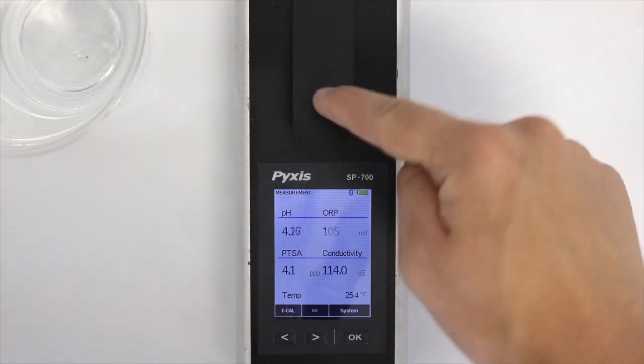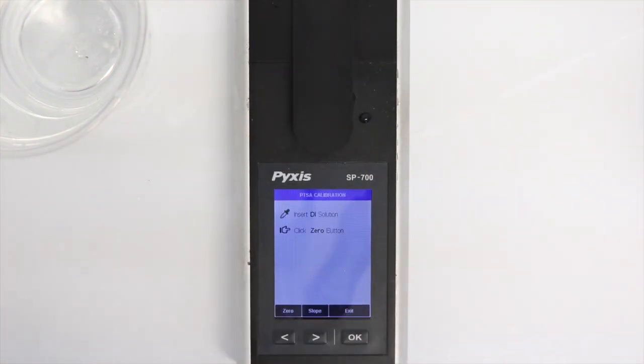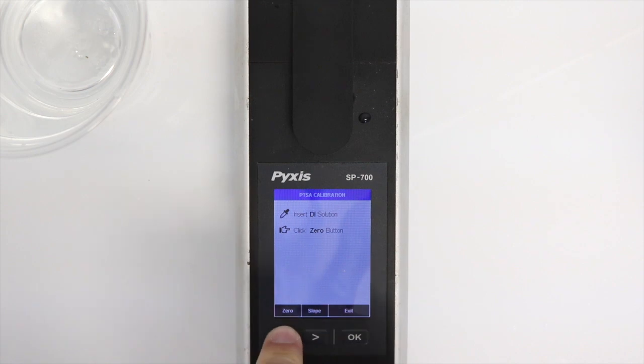Close the shield and select FCAL by pressing the left arrow key. Press the left arrow key to select zero.